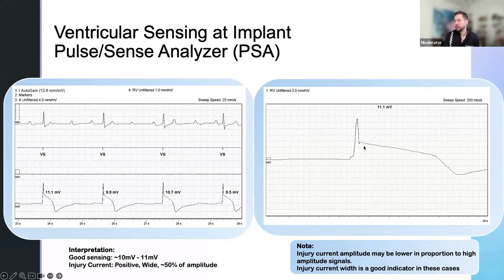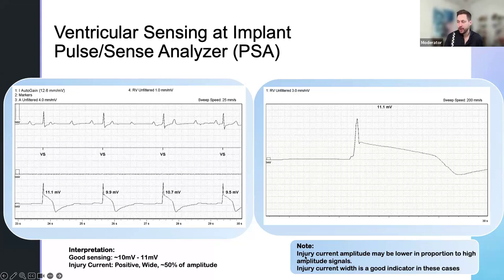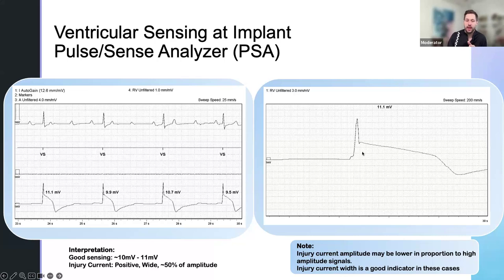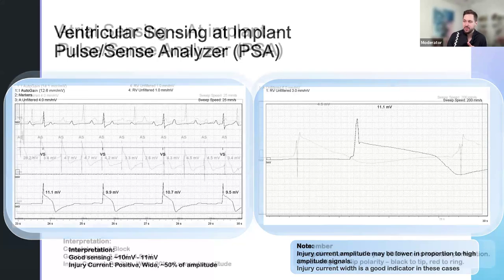Looking at this blown-up version — with the Avid programmers you have a way to take a close look at the signal itself. Looking at the unfiltered signal, you have this beautiful injury current here. I know I'm really driving this home, but it's so impactful when you're doing testing of leads. One thing to keep in mind is that injury current — we always want a positive one, and I'll mention that in the next slide.